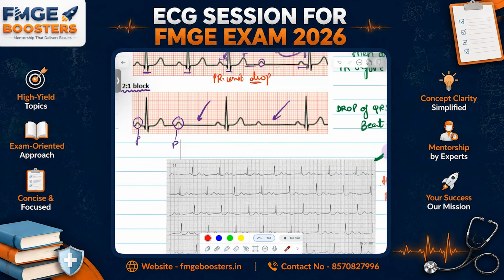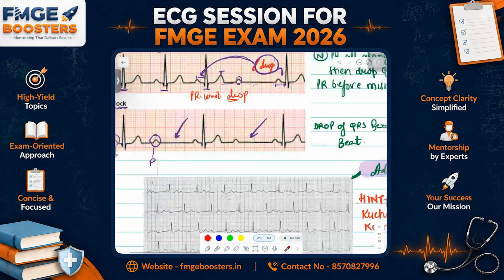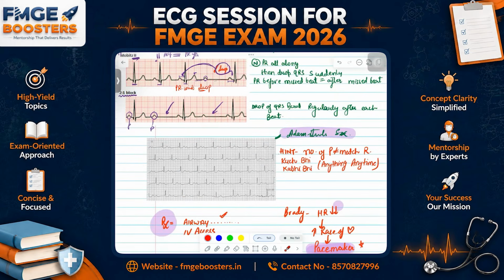एक चीज बताओ बस। देखो, नॉर्मल तो ऊपर वाला ठीक है, QRS और यहाँ का, बस यहाँ का QRS देखो। बेसिकली जब भी ECGs बहुत डिस्टॉर्टेड होती हैं, तो हम QRS के बारे में नहीं सोचते। ये सेकंड डिग्री या फर्स्ट डिग्री वाला ब्लॉक नहीं है, क्योंकि उसमें QRS की मॉर्फोलॉजी मोस्टली सेम रहती है। But if something is like that, कि P ज्यादा है, QRS कम है, या फिर QRS ज्यादा है, P कम है, then it is Adams-Stokes syndrome, which is type 3 heart block, ठीक है?